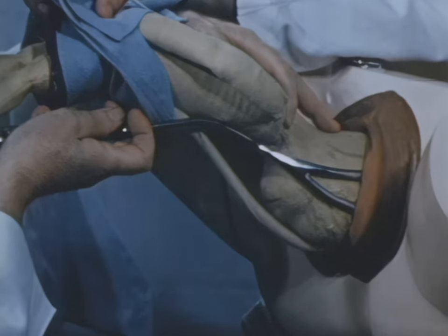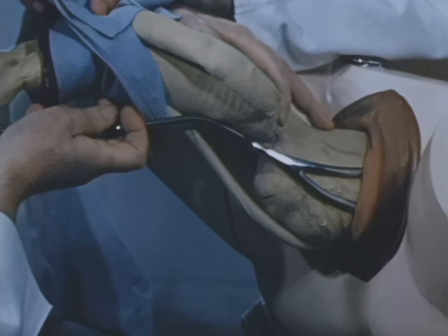Gradually making progress until, with good flexion at the outlet, the head comes out with the handles at the level of the horizon.